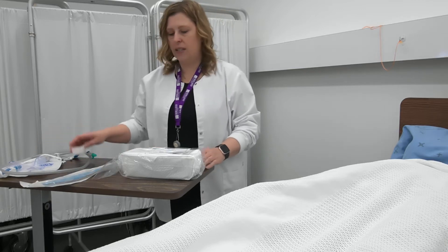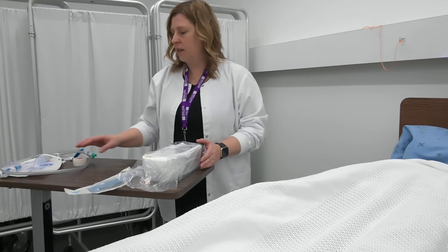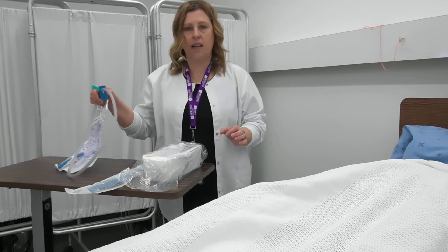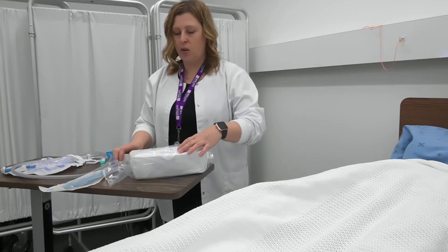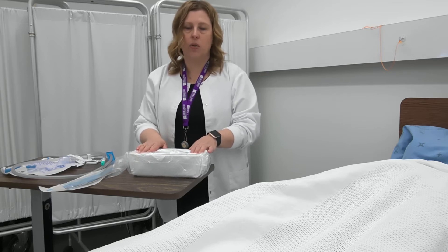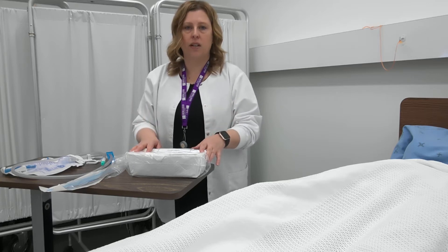The supplies I'm going to need today are one Foley catheter tray, one catheter, some tape, and a sterile collection bag. Inside the kit is a pair of sterile gloves, but they're one size fits most. So if you have a larger hand size, you may want to bring your own sterile gloves with you.